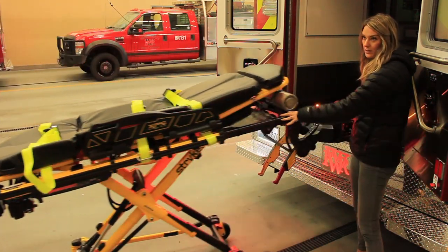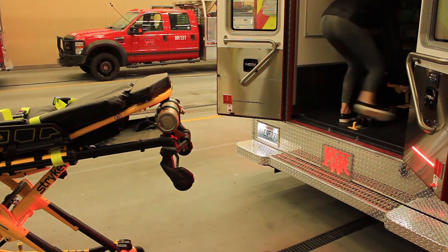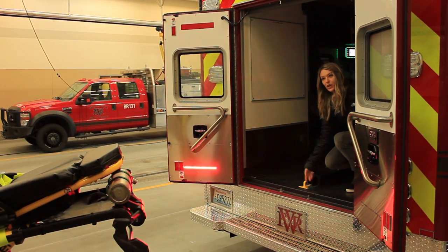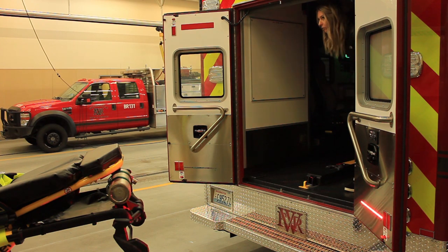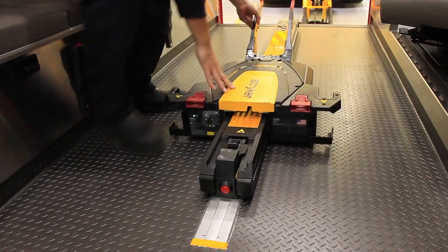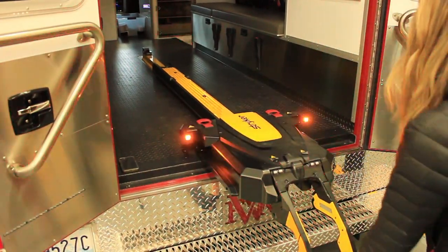Then do the manual release. If the load system is dead and you need to load the cot into the ambulance, lift up on the arms, bring it all the way to the front, and then load on top of it. This is like exactly what you were doing before — worst case scenario, you're doing what you did before. That's why we leave the safety hook there, so you can still load the cot on top if the system isn't working. Once you bring it all the way forward, in order to get it back out, there's a red button on the back that you have to push, and then lift up on the arms to get it to come back out.